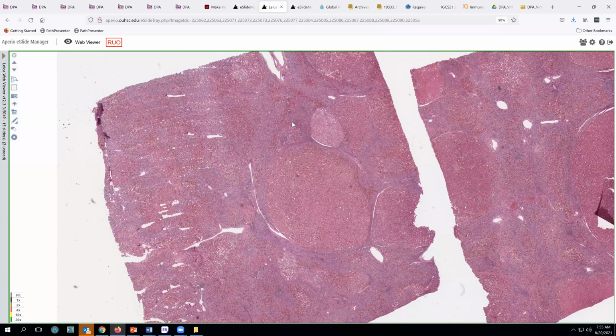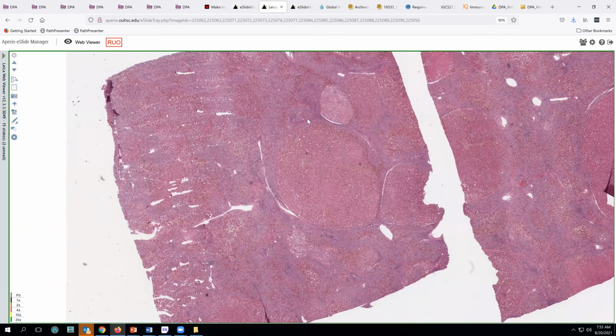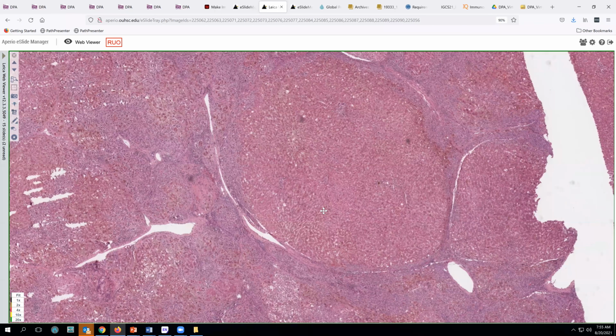So this liver transplant obviously done for cirrhosis, and that's the history that we received. Patient with end-stage cirrhosis, liver transplant, here's the liver. So there was not an indication of the etiology for the cirrhosis. And I think here at low magnification, you can appreciate that we have some sort of variable macronodules as well as this background micronodular pattern cirrhosis.